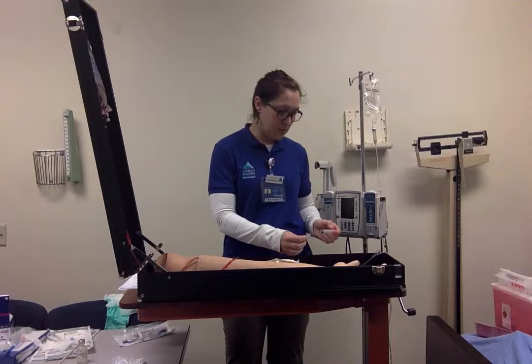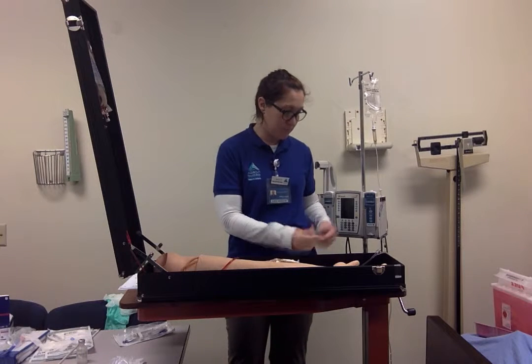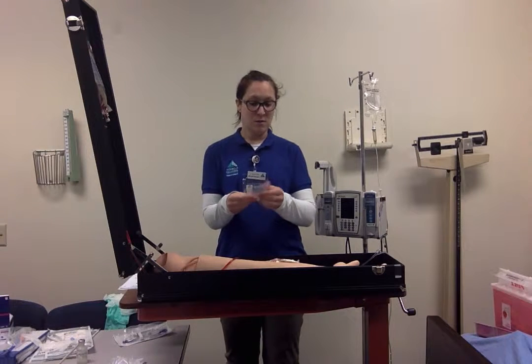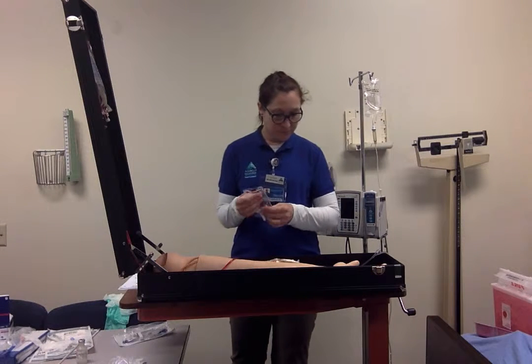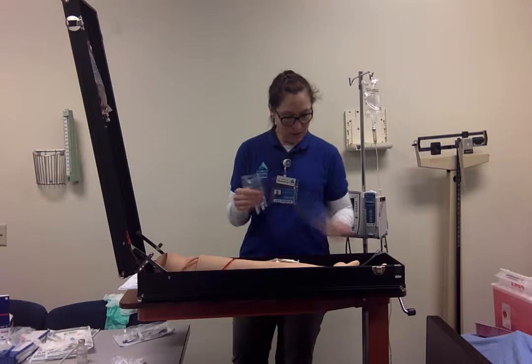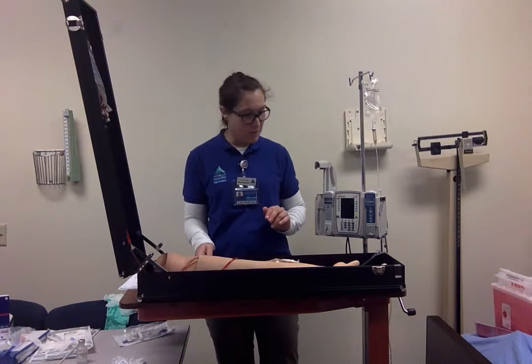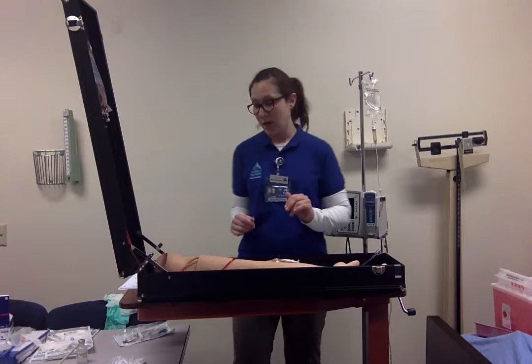I'm going to throw this in the sharps container, not recap it. And making sure that I mix the medication in the bag. Alright, I'm going to set this aside, and next I'm going to attach the needleless device.